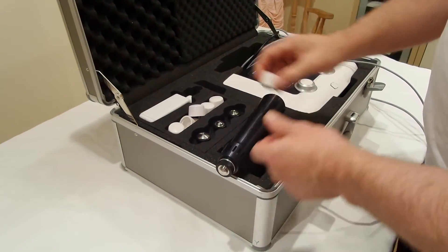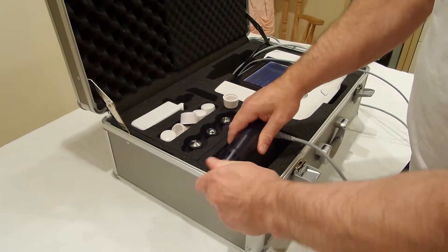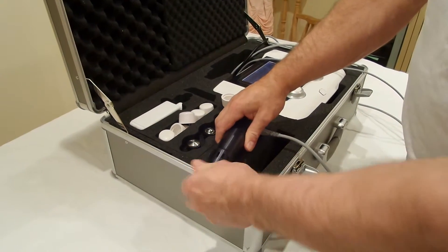This is shockwave therapy to the perineal muscles. Some people would call this myofascial treatment.